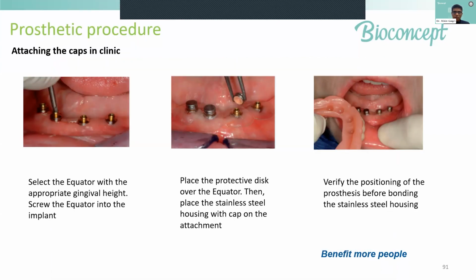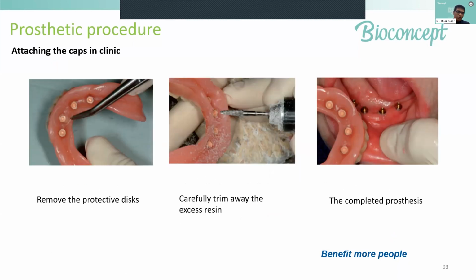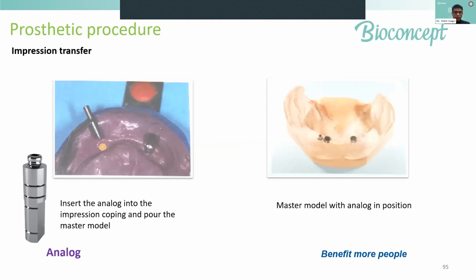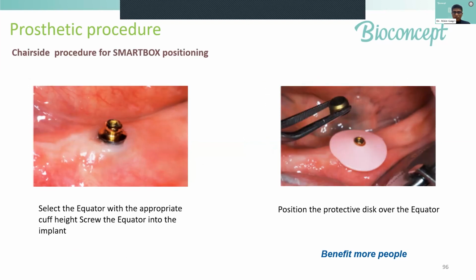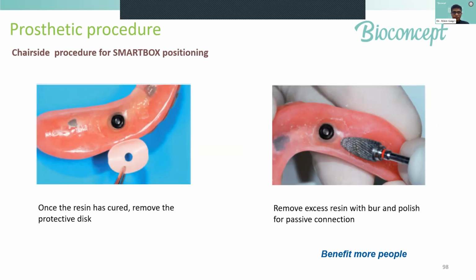On the soft tissue, the male copings are placed, and you do a denture pickup with cold cure in the mouth for best adaptability. That is called direct pickup. Better to do that rather than asking the lab to do the needful. Finish and polish, and the patient is ready to use the semi-rigid prosthesis that you had planned.